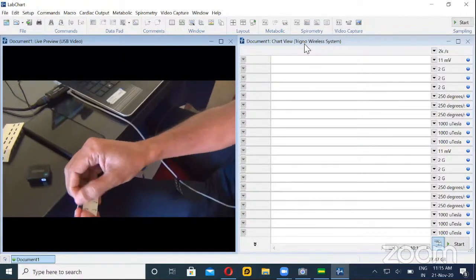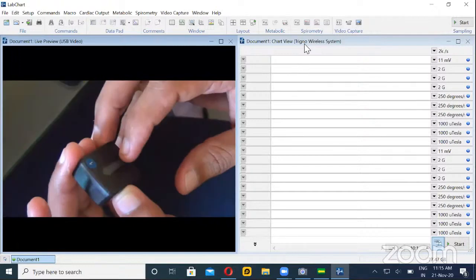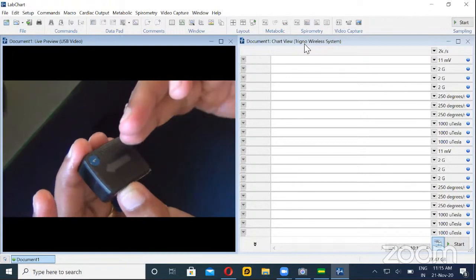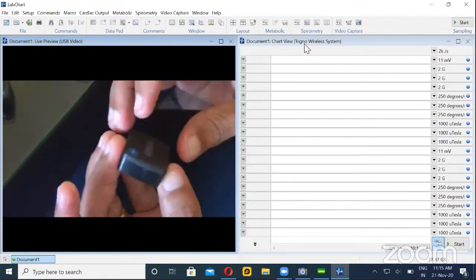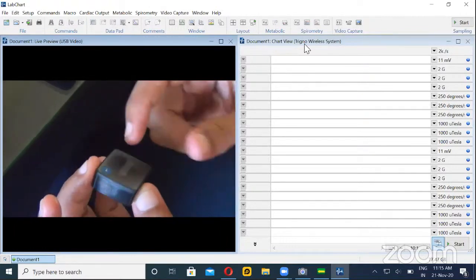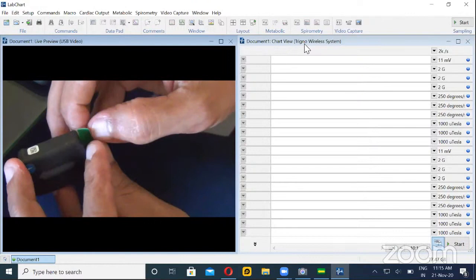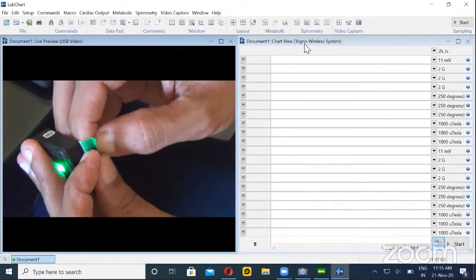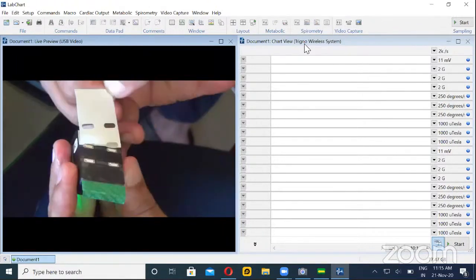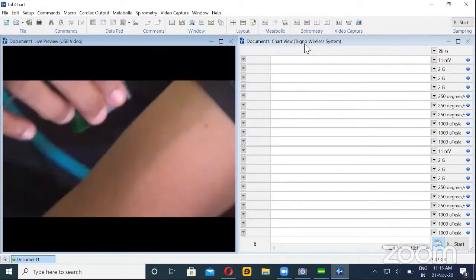This arrow shows you that optimally the arrow should align itself with the muscle fiber direction — if the muscle fiber is horizontal, keep it horizontal; if it is longitudinal, keep it longitudinal. Ideally to get the other parameters, this arrow should be pointing upwards. Now I'll remove the other side of the sticker and place it on my biceps muscle.